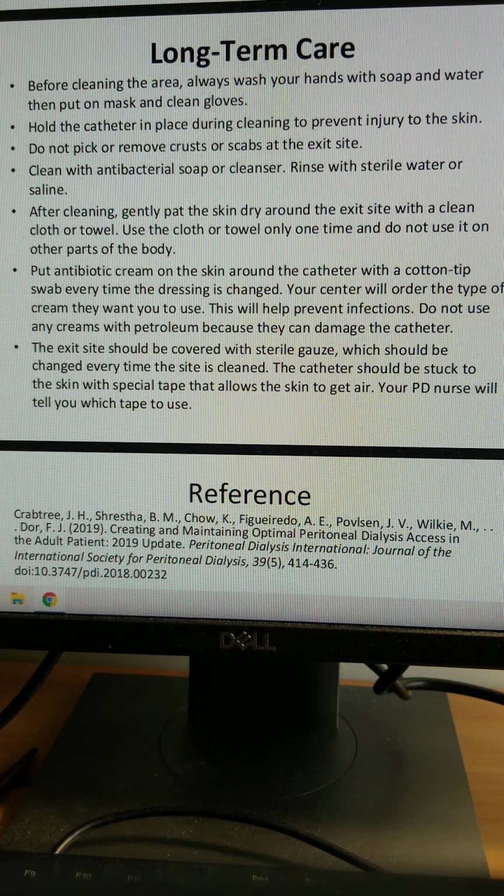If you get peritonitis many times, or if it lasts a long time, then you may need to stop PD and change to hemodialysis. Most centers will recommend that you keep the catheter in place with tape. If the catheter moves a lot, you may harm the exit site. So don't let the clothes tug on your catheter.